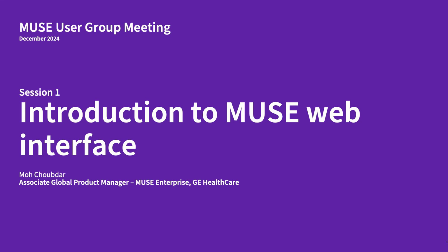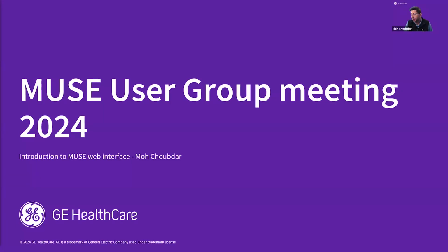So, as Sophia said, I'm the global product manager for Muse Enterprise. I am here to talk about the web client a little bit with you and Muse NX R2. But any questions, comments, anything you want to relate to us, please feel free to share it in the chat. After I'm done presenting, I'll answer all questions and take all the inputs you have for us. I appreciate your engagement there.